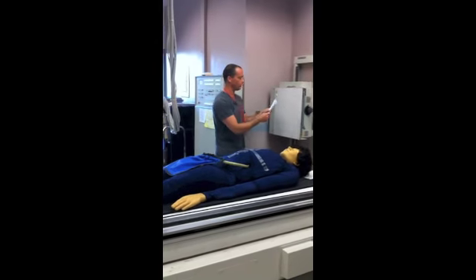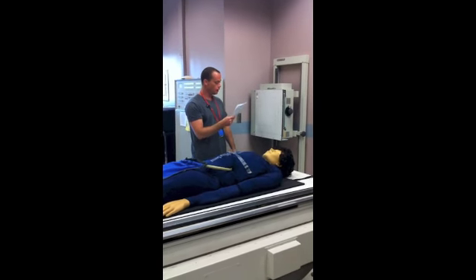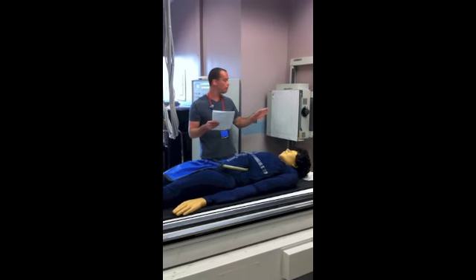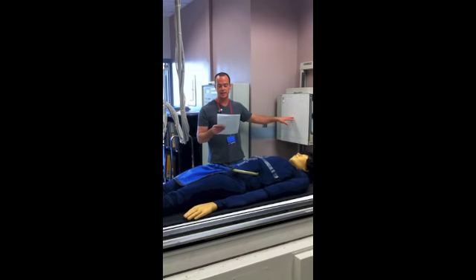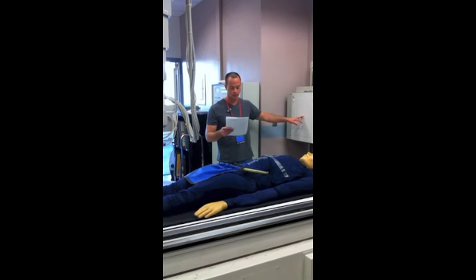The patient's mid-coronal plane is vertical, and the central ray will be perpendicular to the IR, entering at the level of T7. And also, you could use the inferior angle of the scapula.